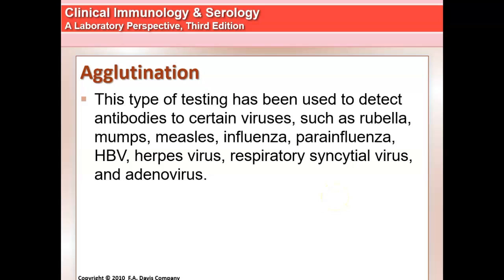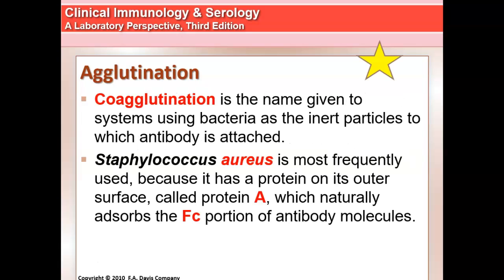This type of testing has been used to detect antibodies to certain viruses such as rubella, measles, mumps, flu, parainfluenza, hepatitis B, herpes, respiratory syncytial virus, and adenovirus.